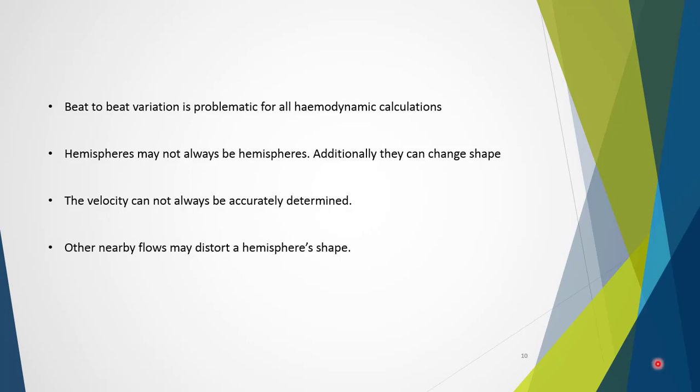There are also considerations for the determination of hemispheres. The isovelocity contours or effective shells flatten immediately proximal to the orifice, effectively changing the shape, and assumed volume within this will then be incorrect. Using a baseline shift that's not too extreme, i.e. a higher velocity for the aliasing point, minimizes this effect.